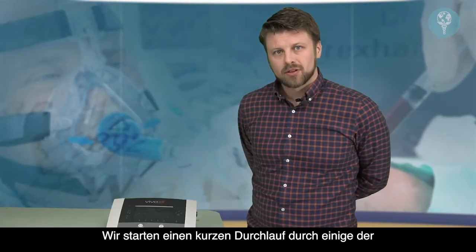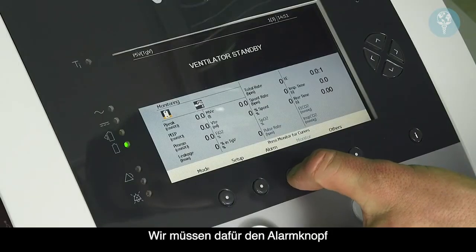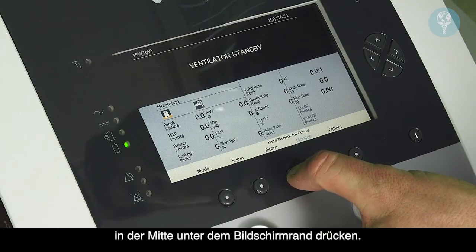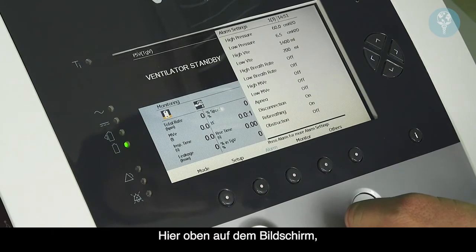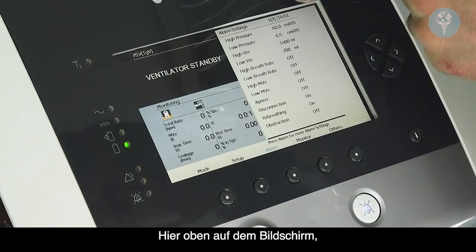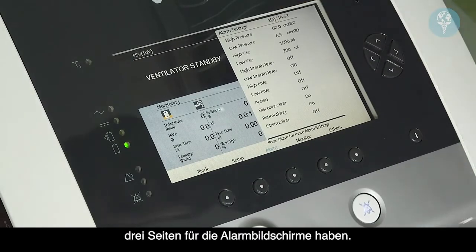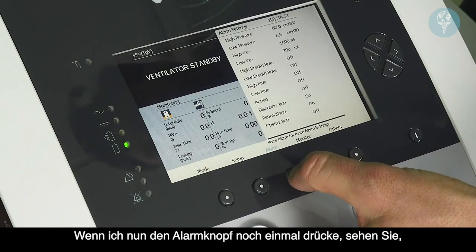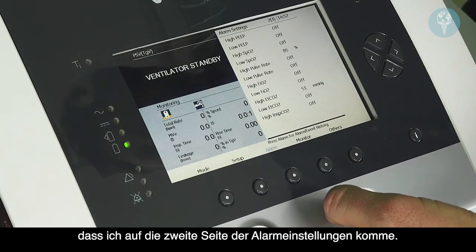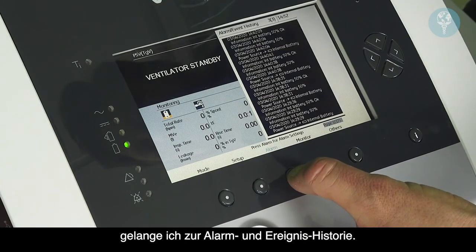Now we're going to have a quick run through some of the more advanced monitored alarm values on the Vivo 55. What we need to do is press the alarm button in the middle at the bottom of the screen. At the top of the screen it will say 1, and then a bracket and a number 3, which indicates that you have 3 pages for this alarm screen setup. If I press the alarm button again, I go into the second page of alarm settings, and if I press it once more, I go into the alarm and event history.